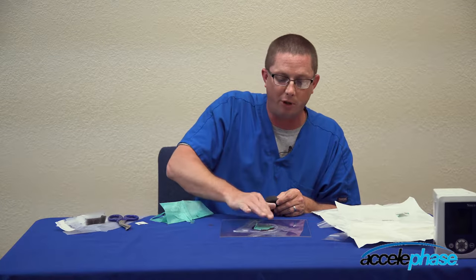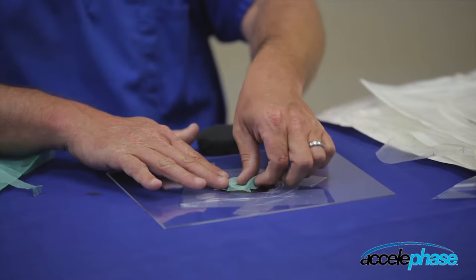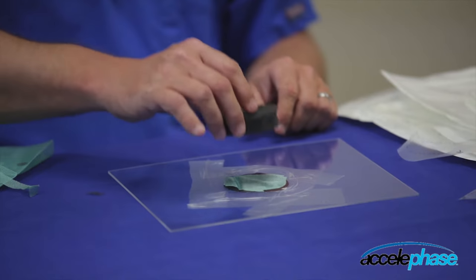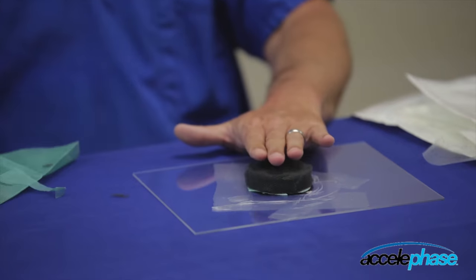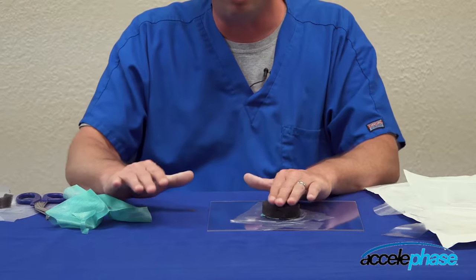This is just a contact layer that lays down in the wound base first. You want to make sure it's flat on the wound base, then lay the piece of foam right over the top of it — it acts as a contact layer only. Sorbac can also be used in tunneling and undermining areas. You just need to leave a pigtail hanging out by about half an inch touching the foam, and it will provide negative pressure wound therapy.